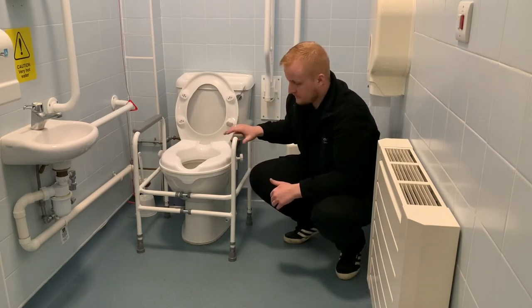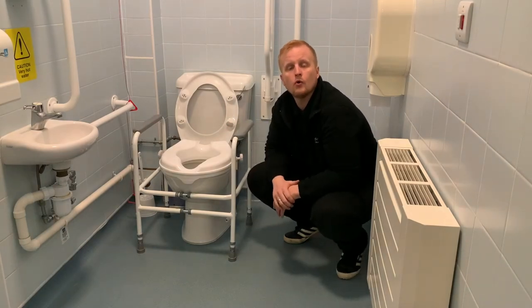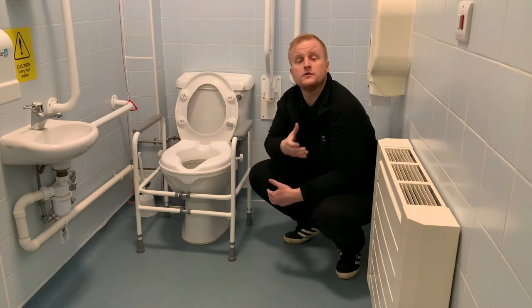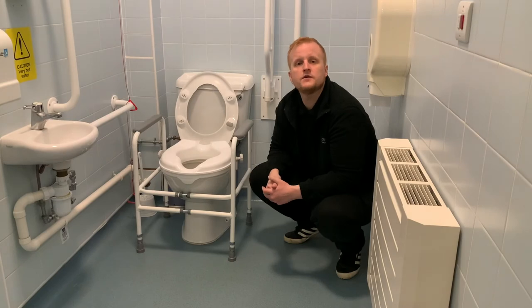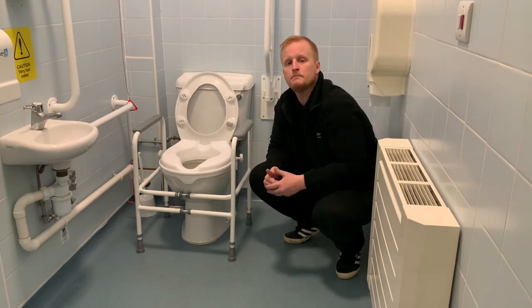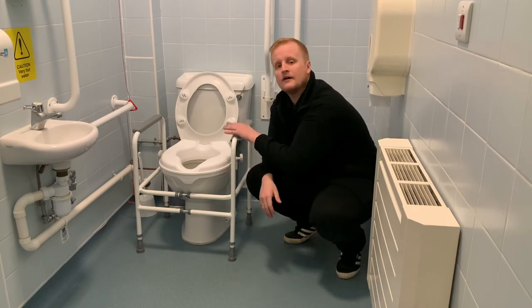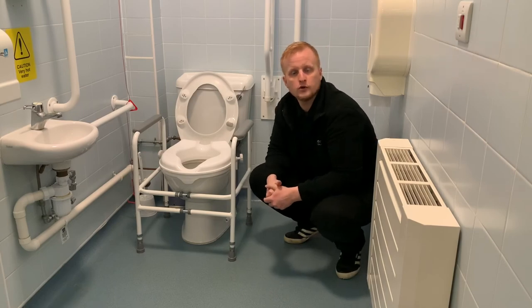We can get this floor-fixed so that those of you who may have had a stroke or certain conditions like MS, it won't wobble, giving you safer and more stability when doing your transfers. What we do have to consider is if you have any underfloor heating or if you have a sloped bathroom floor — maybe because you have a level access shower — you would have to go with either this or an alternative piece of equipment to support you with those transfers.